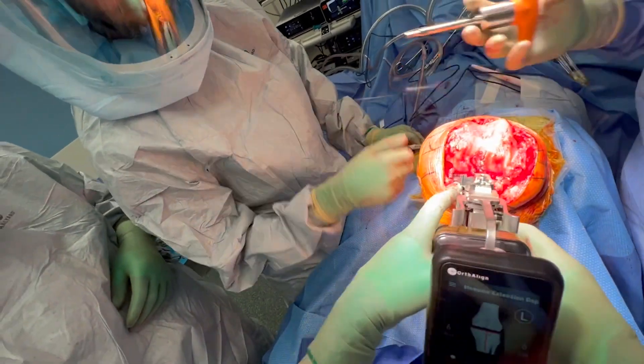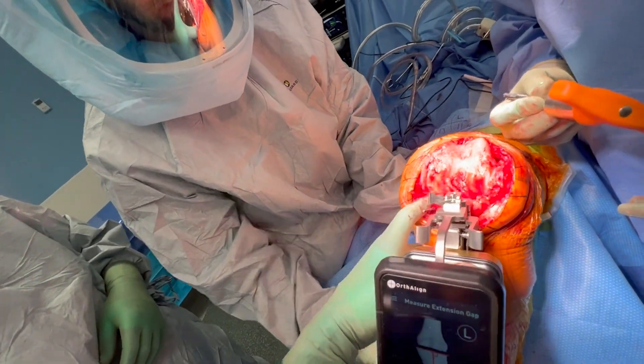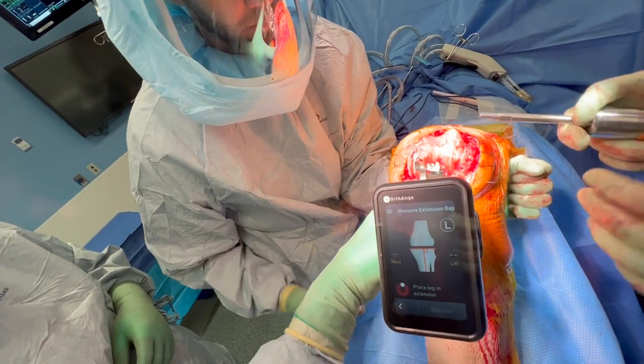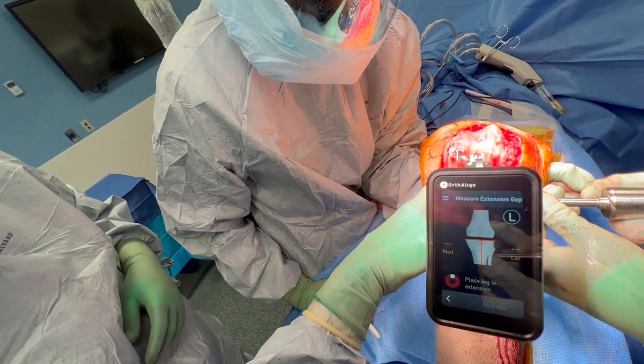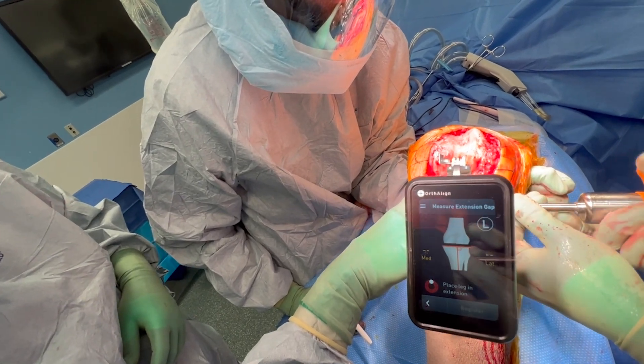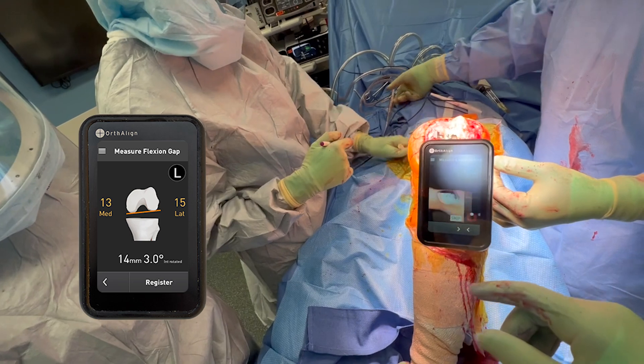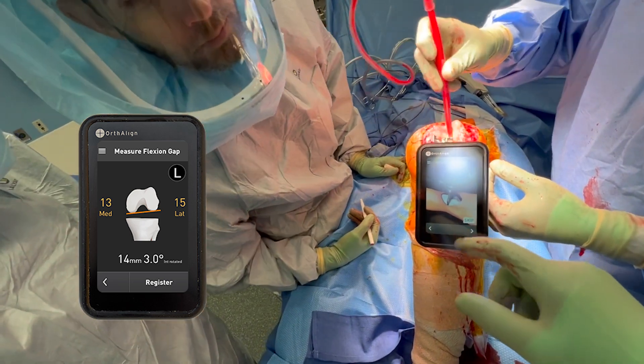Now we go back in and check her flexion gap. Again, make sure those paddles are even on the medial and lateral condyle. I have my assistant lift the weight of the femur — I don't want to distract the knee, but I don't want the weight of the femur sitting on it. We turn the torque wrench and get these numbers: 13 millimeters on the medial side and 15 millimeters on the lateral side in the flexion space.